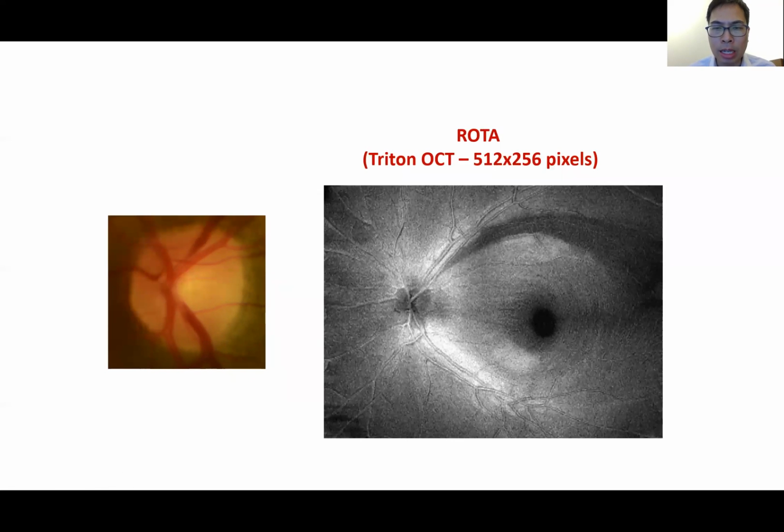Again, this is another example to demonstrate why wide field imaging is important, because when we look at the rim, here is another case, we don't see any abnormalities. Only when we study the retinal nerve fiber layer over the wide field can we appreciate the damage, obviously. The reason we don't see any abnormality in the rim is that for damage like this eye, it's a very focal loss of the axonal fiber bundles. And you can see the wedge shape of the retinal nerve fiber defects.